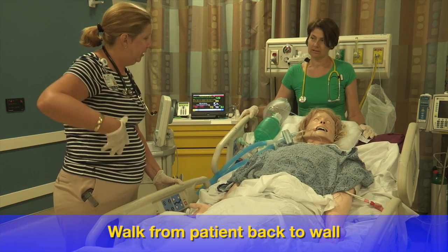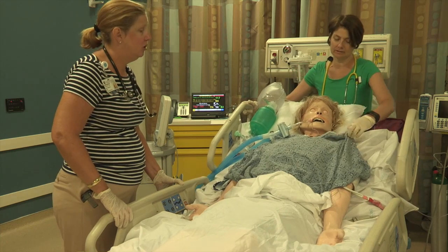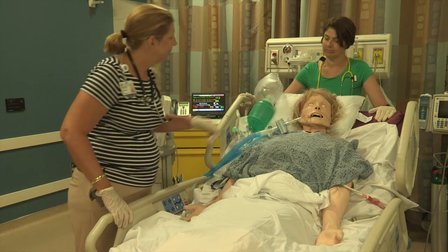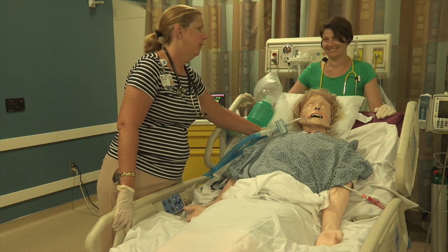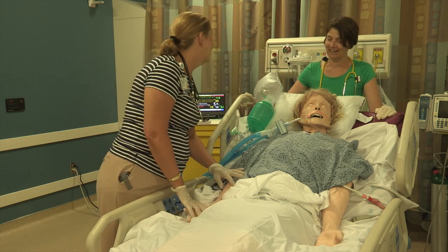I'm going to get the head of bed back up and order a chest x-ray. She doesn't have any chest tubes, so we're not worried about that. People often forget when they don't take the gown all the way down — if they do have chest tubes, you've got to make sure they're on suction. I'm glad I had that acute care apartment course; otherwise I wouldn't know how to put this stuff together.